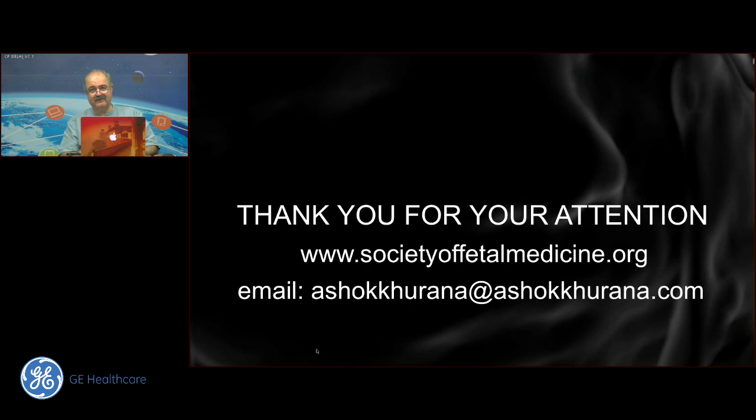Later on, of course, you learn to recognize it because you get so used to the image. So you get used to what we call pattern recognition or intensity recognition. And perhaps in the future, we might actually use artificial intelligence to identify how echogenic this kidney is. So I will take an image and send it to an agency that recognizes renal echogenicity, and I have an answer. It tells me echogenic versus not echogenic kidneys. Or it tells me, look, can you please send me another image after switching off harmonics, and I'll tell you whether this is echogenic or not echogenic and how abnormally echogenic it is. And that is the future, artificial intelligence.